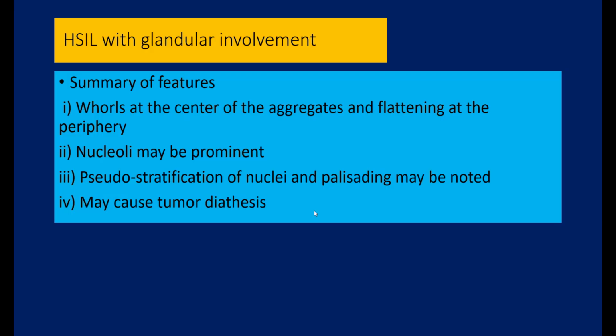So HSIL with glandular involvement, again, what helps to differentiate from glands, it shows whorling at the center of the aggregates and flattening at the periphery. Nucleoli, as I have said, may be prominent, so do not use nucleoli to differentiate between HSIL and glandular changes.